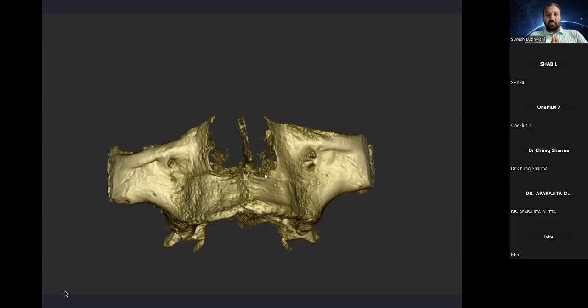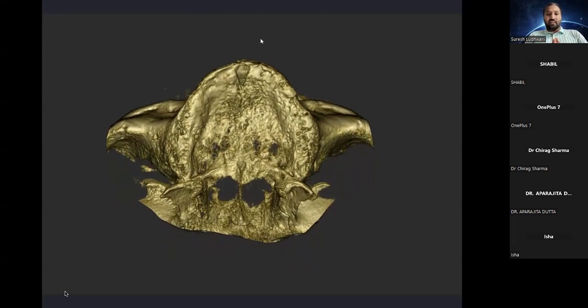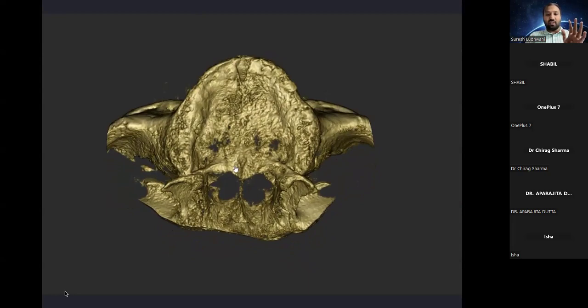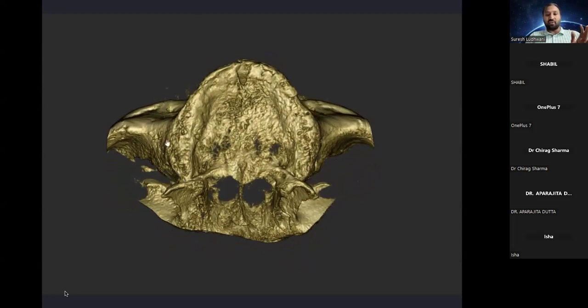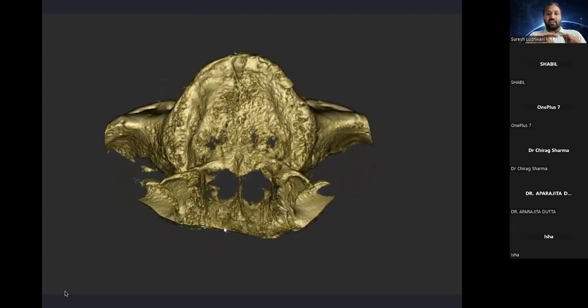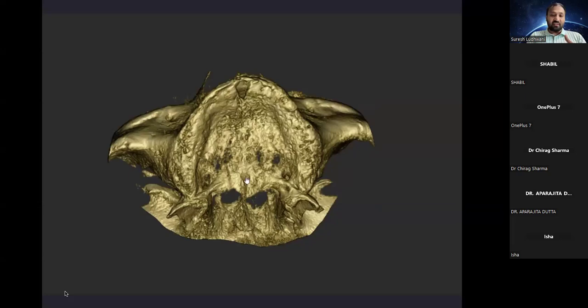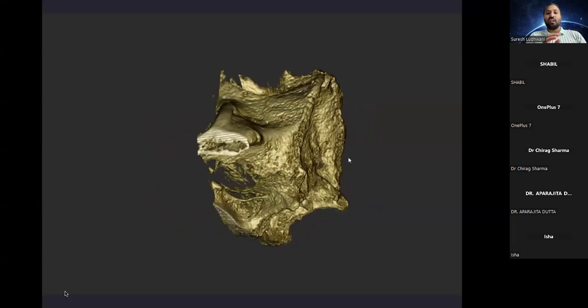This is something you need to see. This is your maxilla. In this maxilla, we have understood all three parts. First, the tuberosity bone. Second, the palatine bone going with its wing and forming a pyramidal process, and then the pterygoid plates. These pterygoid plates, one is medial and the other is lateral. That fossa, the junction, is where you are supposed to go and hit.